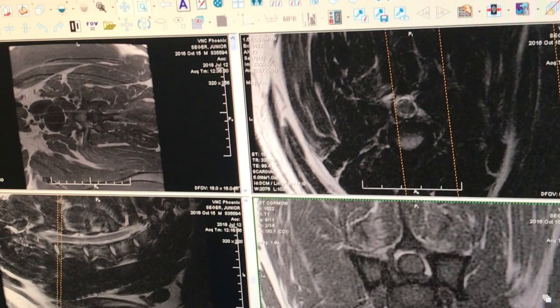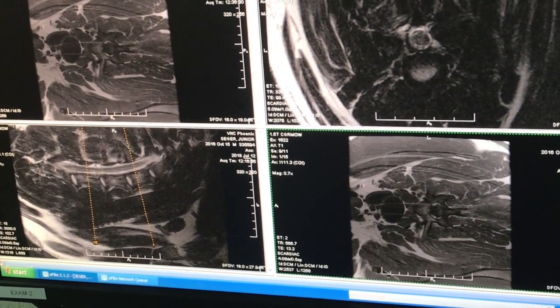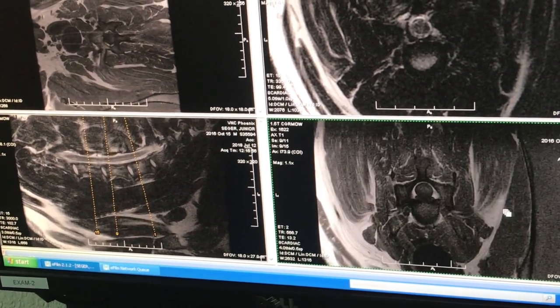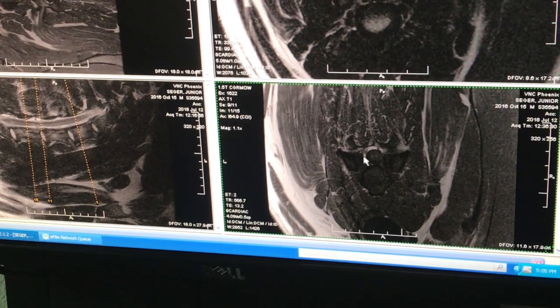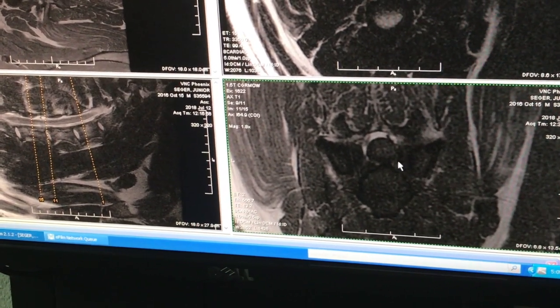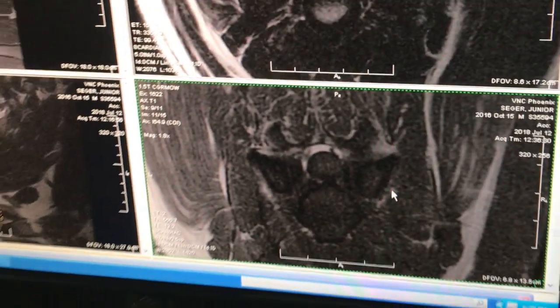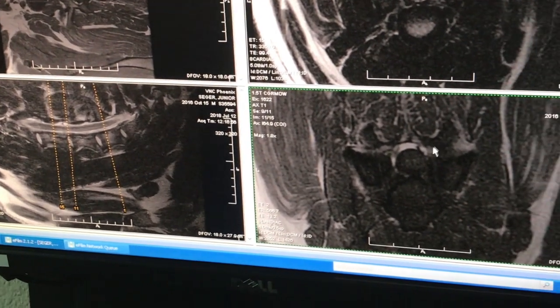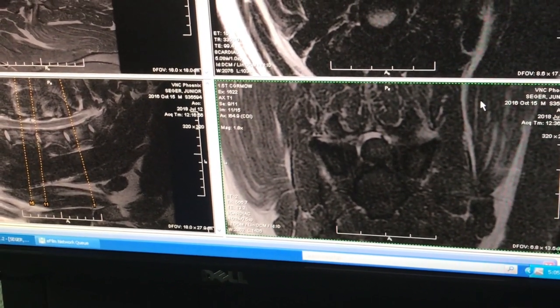The next area is a little lower down in the lower neck. This is right at C5-6, and again this is normal in appearance here. As we move closer we lose that nice CSF fat column on the right side — it's gone there — and that is because of the proliferation of the bone in that area. That's causing stenosis, basically making the canal smaller. It's slightly smaller than the outside, but not as pronounced as at C4-5. This occurs mostly because of bony proliferation but also because of some proliferation from the joint capsule right at that articulation.